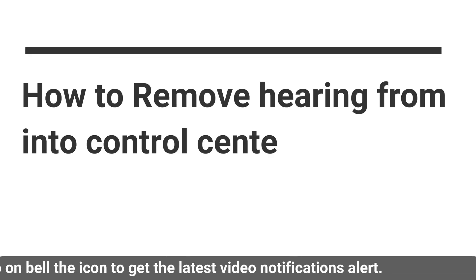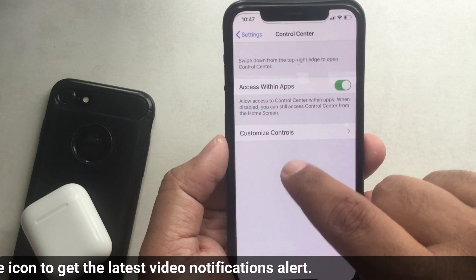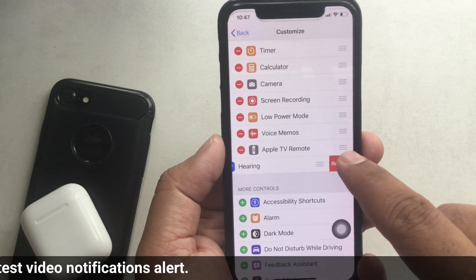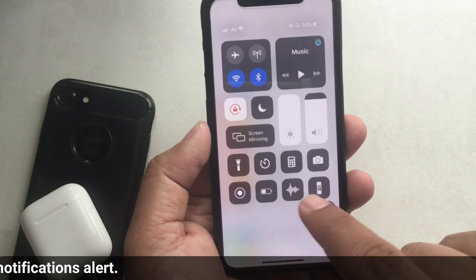To remove Hearing from Control Center on iPhone, open the Settings app and tap Control Center, then tap Customize Control Center. Find and tap the red icon next to the Hearing tab, then tap Remove to delete the Hearing tab from the control panel. That's it.